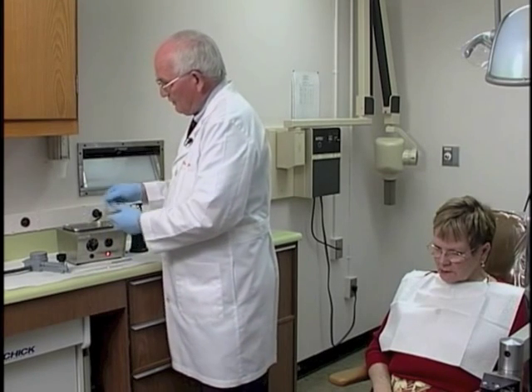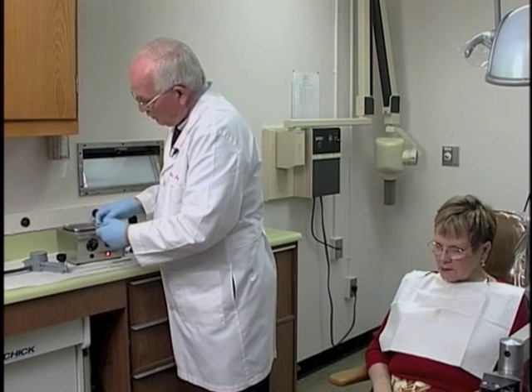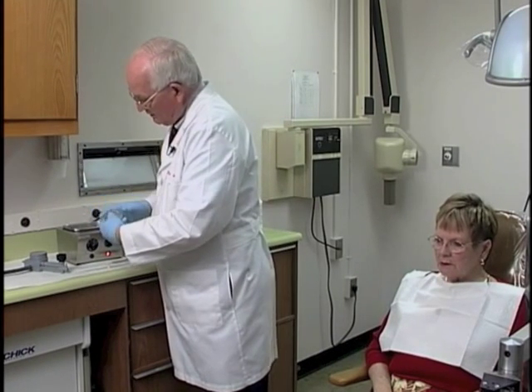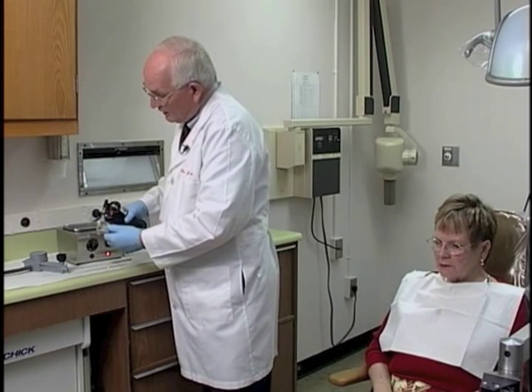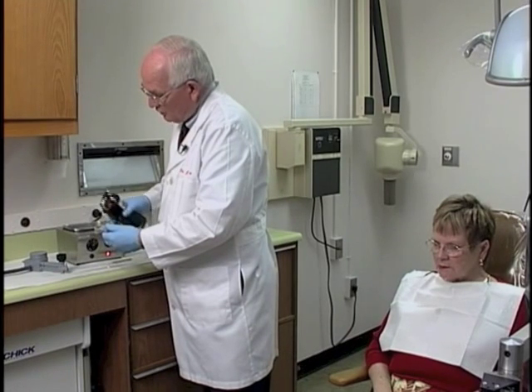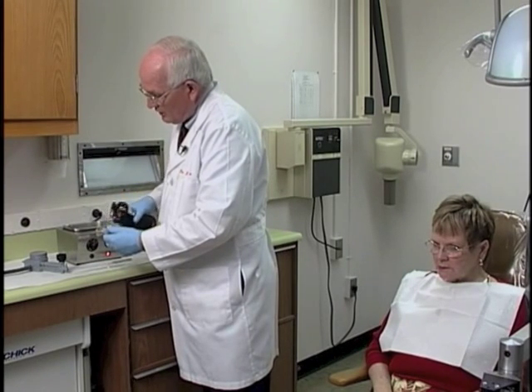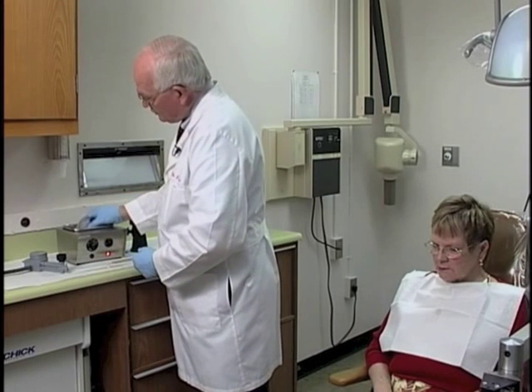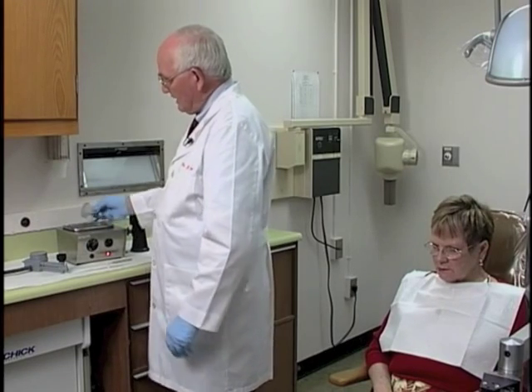Once it's applied to the periphery, then we can wet the fingers and mold it up a bit, to build it up just a little bit. They stand up on the periphery some. Once we've done that, we take our Hanau torch and again heat the material till we know it's particularly soft, and watch the areas where it's joining another section that's previously border molded to make sure it blends in well with it. Once it's superheated with the torch, we temper it again for 3 to 5 seconds.